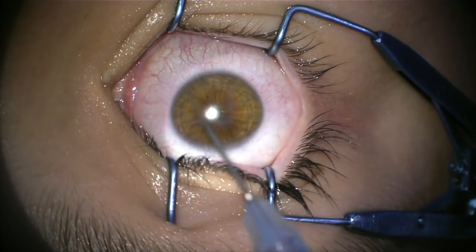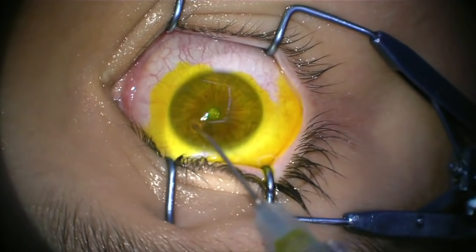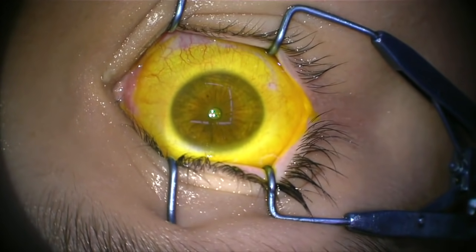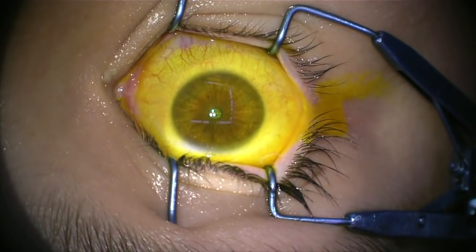Now the riboflavin is applied to the cornea. This is a yellow mixture — that's the natural colour of riboflavin. Depending on the protocol that we use, this is left to soak into the cornea for anywhere between 10 and 30 minutes.